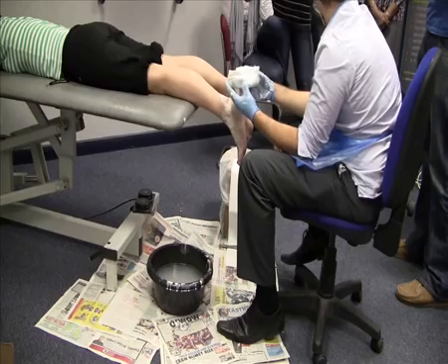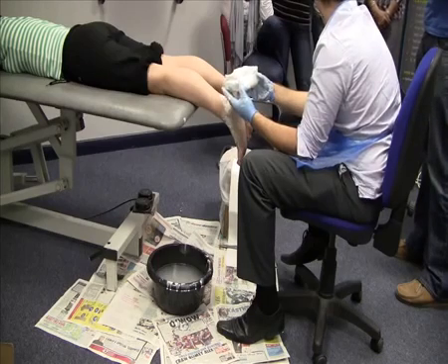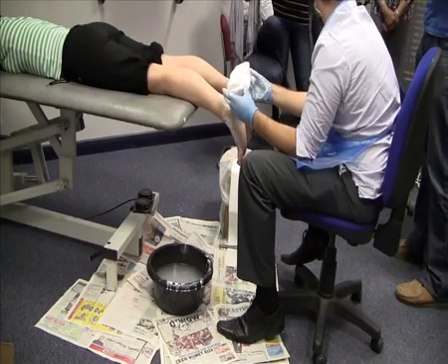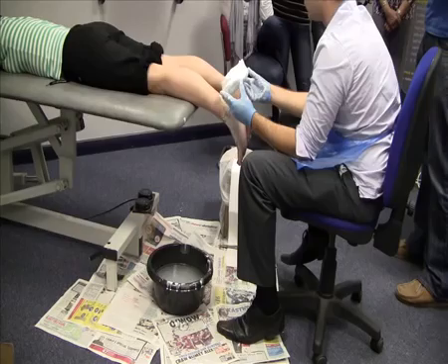Again, if it's in the morning, I'd still probably leave it a day if you can. If you want to get it off and manufacture quickly, then it doesn't matter too much, just send it towards the end of the day. Just give it a couple of hours on the side.